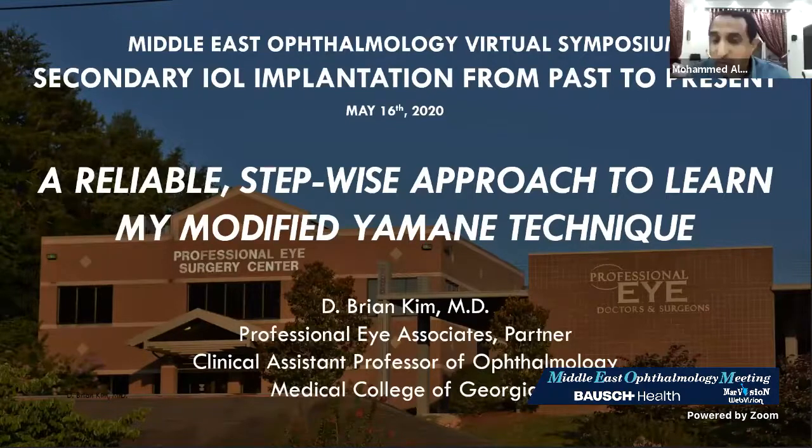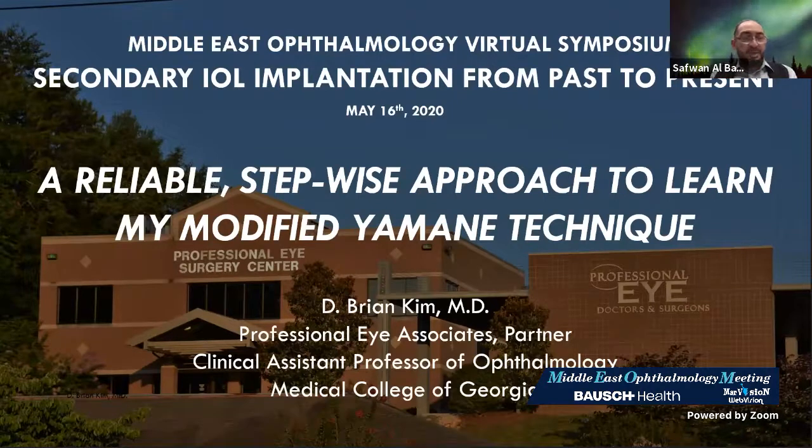But okay. If you don't mind, just one minute. If you are taking the trailing haptic and pressing it down more, you might touch the retina. So here, with experience, you will not do it. But still, there is a risk when you are pulling the trailing haptic more and pushing down. Yes, Mohammed. Thank you. Okay, please.